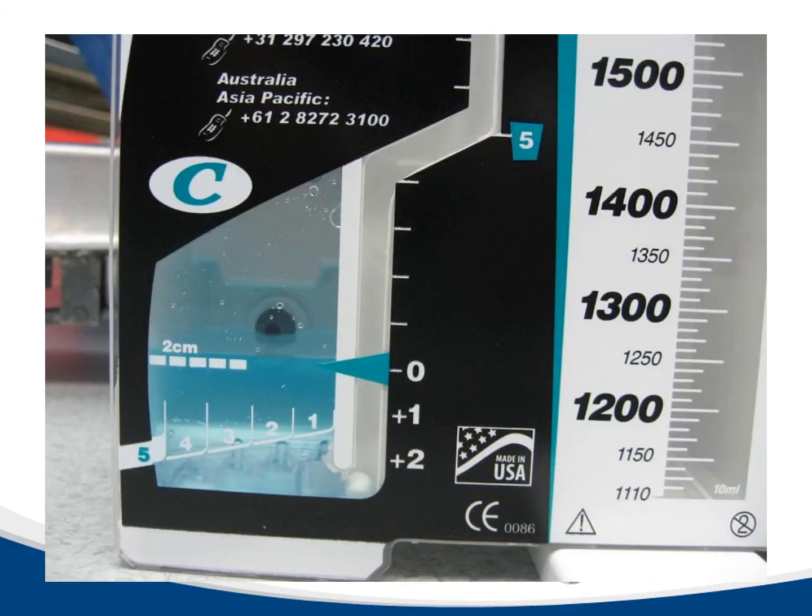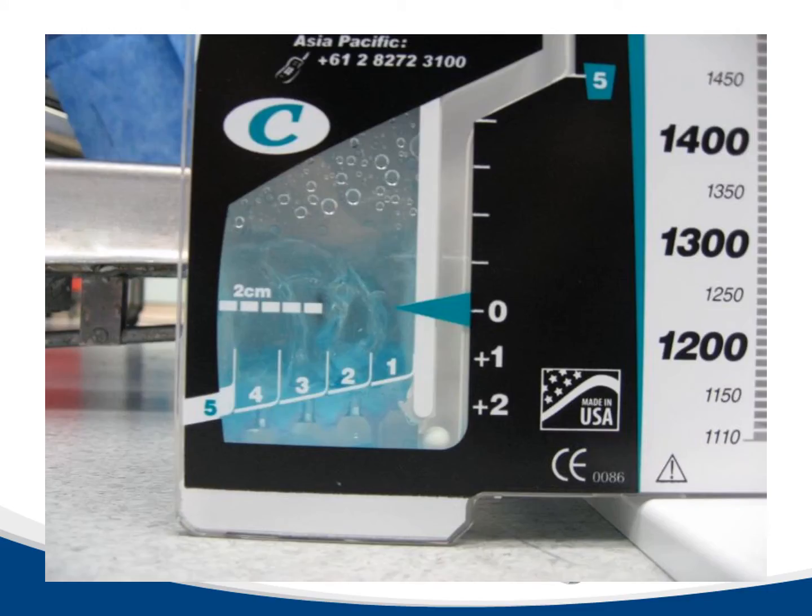Instead, this is a CDU that has the normal saline in the water-sealed chamber up to a proper level of 2.0 centimeters. The CDU shows a large amount of air bubbling in the water-sealed chamber. If the chest tube is properly positioned and the system is intact, this bubble of air usually comes from an air leak in the chest cavity. The water-sealed chamber has a graduated air leak monitor to estimate the degree of the air leak.